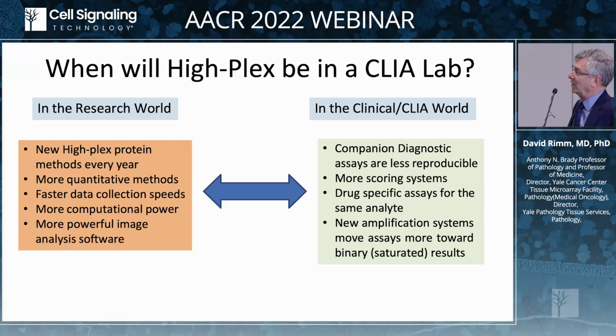And so when will High-plex be in a clinical lab? I told you that quantitative fluorescence is already in Scott Rodig's lab and soon will be in our lab, and those are CLIA labs. But in terms of High-plex in CLIA labs, I don't think it's going to happen.